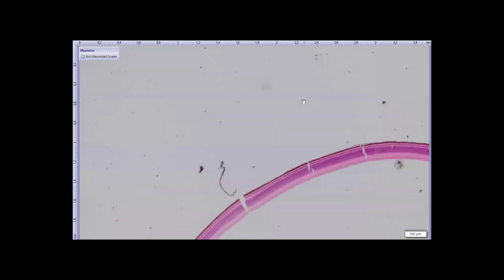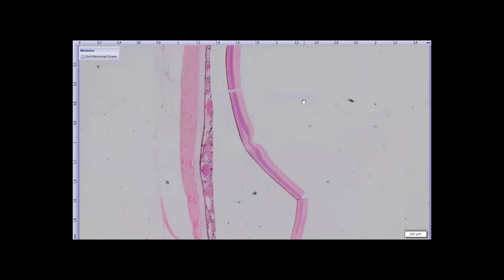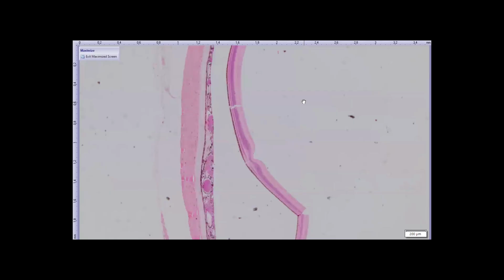So most birds, as I've said before, have a fovea, which you can see here. I shouldn't even say most birds. Many birds have a fovea. I don't know if it's more than 50%. And then some birds, relatively few, but all of the diurnal raptors, the eagles, hawks, falcons, and there's another one that I'm forgetting, have not one but two foveas in each eye. So this is our attempt to sample both foveas in a red-tailed hawk.